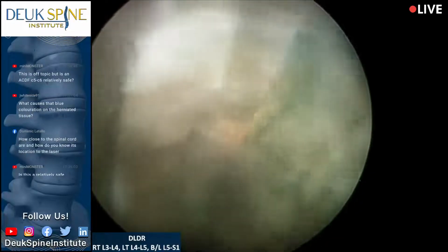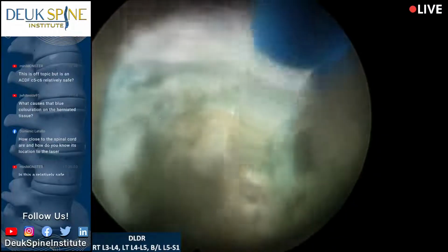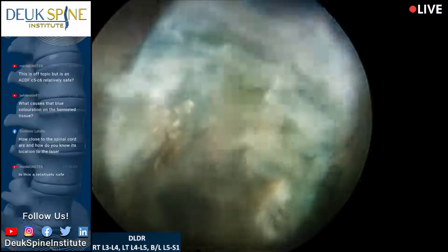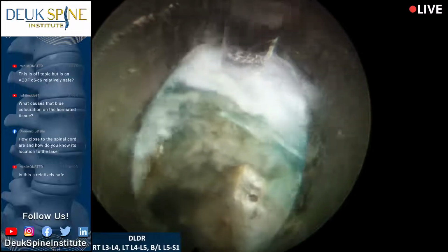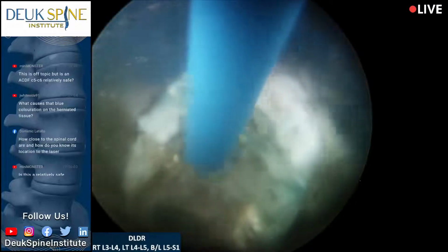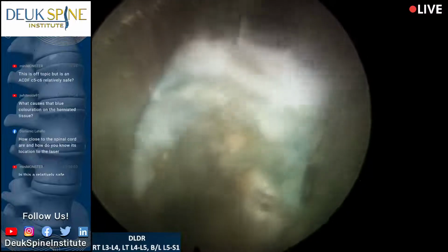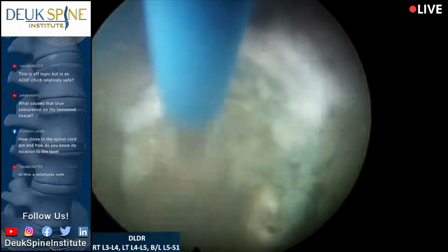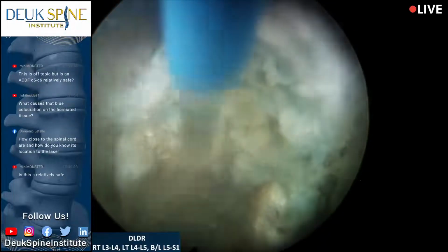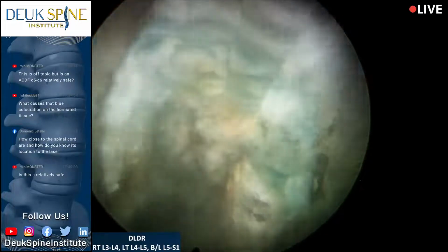It won't pick up the dye. But the fact that it's picking up the dye means that the herniation is at least a few days old. So it's starting to degenerate. And what makes it bind the dye is it's acidic. So acidic means acid. And the herniation normally would not bind the dye. Like normal disc material, normal nucleus pulposus would not bind the dye. So the fact that it's binding the dye tells me it's already being degenerated by the inflammatory process. And it helps me find all the pieces of herniation that need to come out.